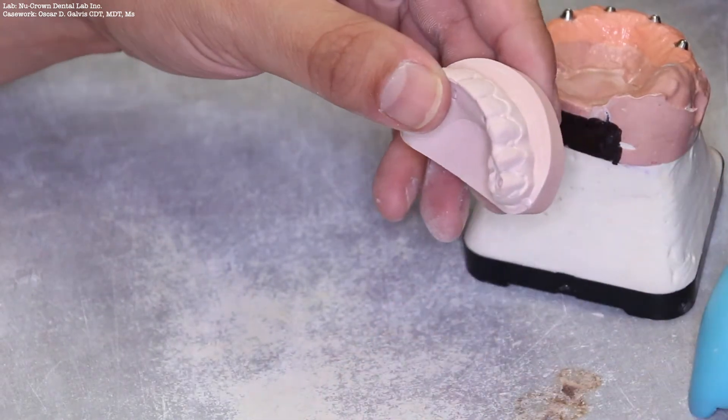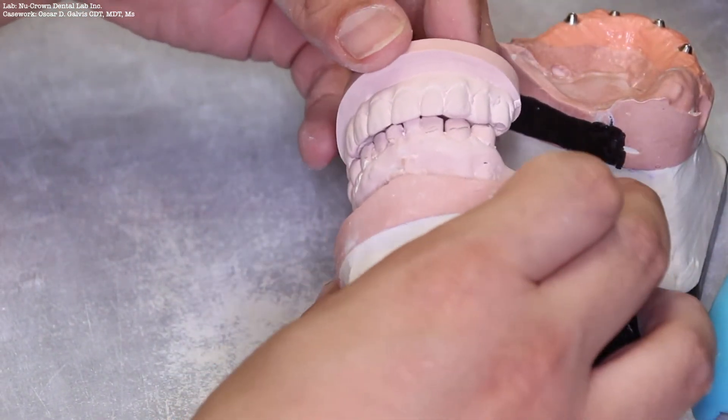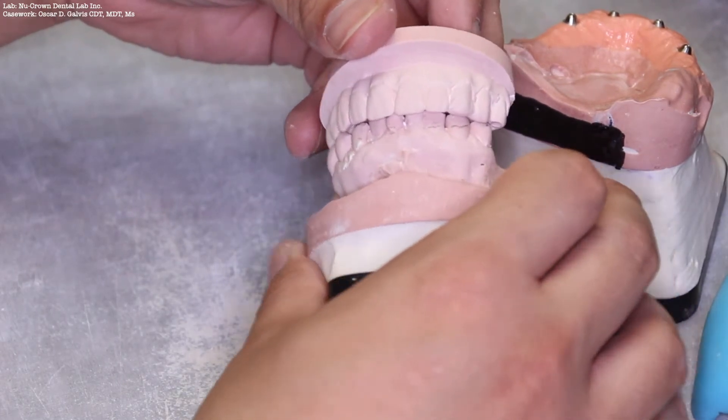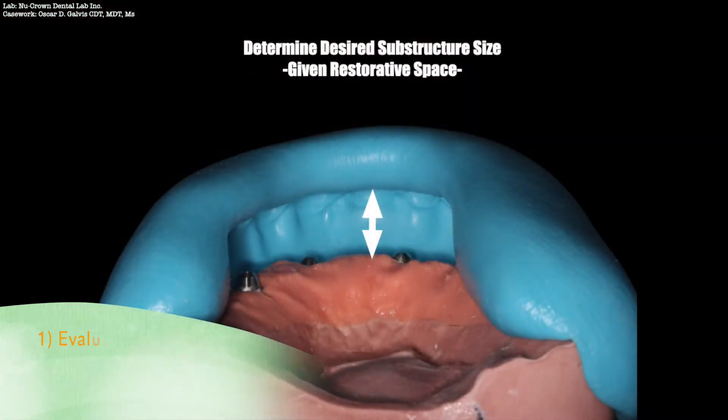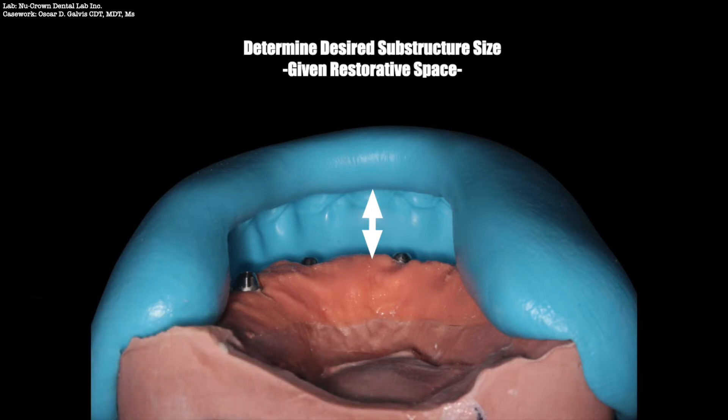In this instance, the patient is wearing a temporary restoration. A temporary restoration can aid in the evaluation of occlusion and restorative space. A matrix may be made over the temporary arch on the model or even a previous try-in in order to evaluate the restorative space.